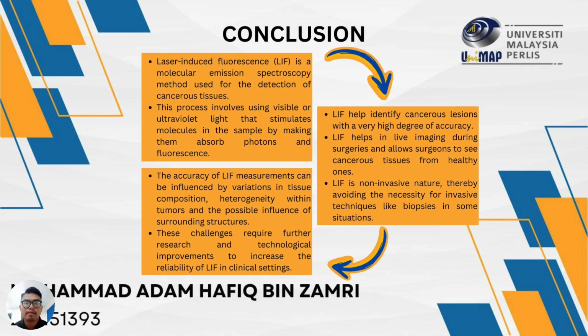Okay, for my part, which is the conclusion of this report, what I can conclude is that laser-induced fluorescence, also known as LIF, is a molecular emission spectroscopy method used for detection of cancerous tissue. This process involves using visible or ultraviolet light that stimulates molecules in the sample by making them absorb photons and fluoresce.